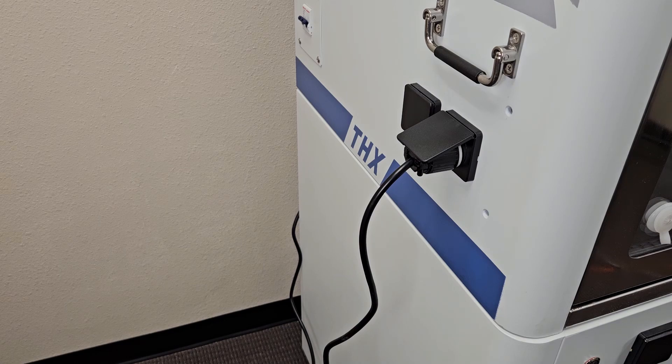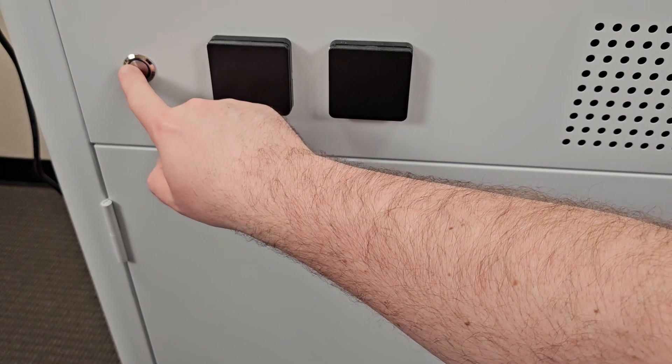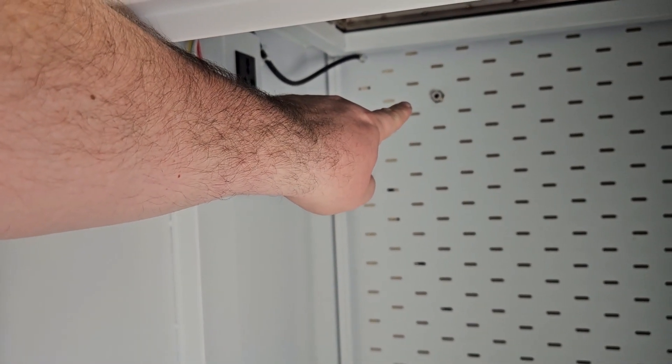If your configuration includes a rolling cabinet drawer, ensure that the power cord on back is plugged into an outlet, either in a wall plug or into one of the plugs on the side of the ICU cage. You can turn on power to the rolling cabinet drawer by pressing the power button next to the front outlets. There is also an outlet inside the large cabinet to plug in an oxygen concentrator, and a port in the back to feed your O2 line through.